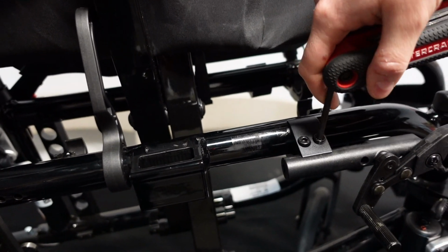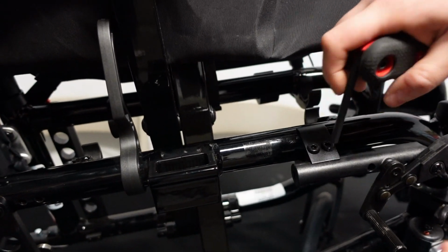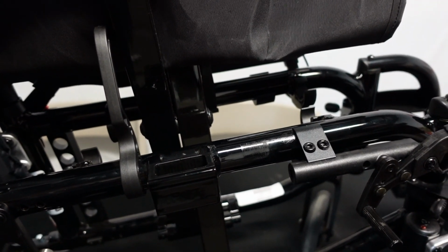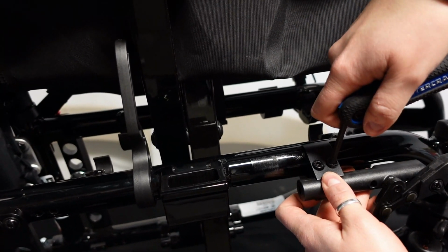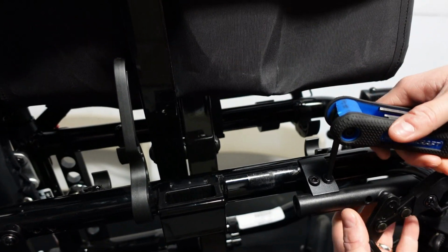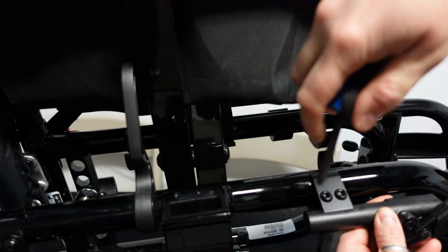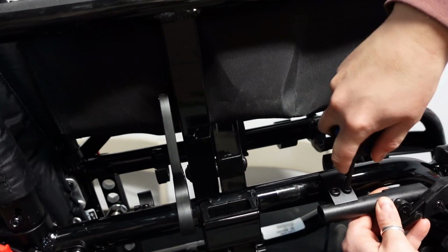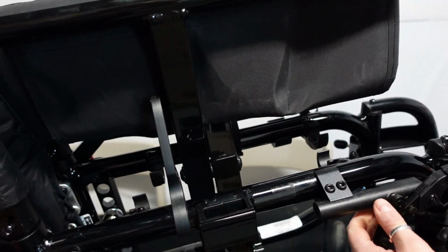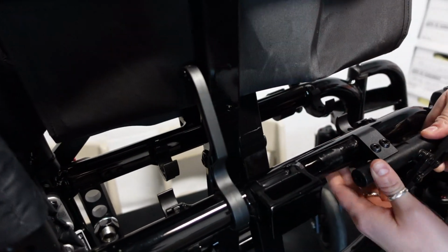As you can see, there's lots of play in this Allen key, and the next size up is obviously too big, so that's the wrong Allen key. We're going to go with these ones. Make sure that they're in there. Yeah, that's nice and tight. Then we're going to loosen them just a little bit, so we can have a little bit of play, because you can manipulate these. You're just undoing that. We're going to go back just about here.